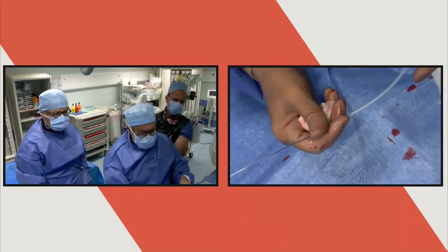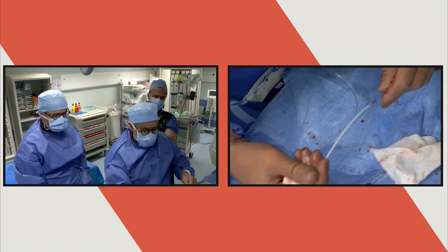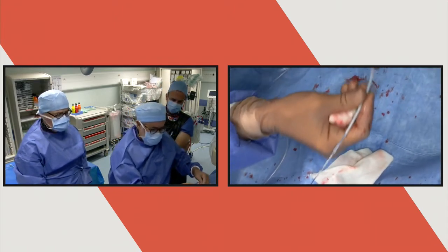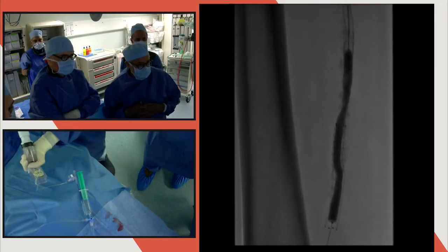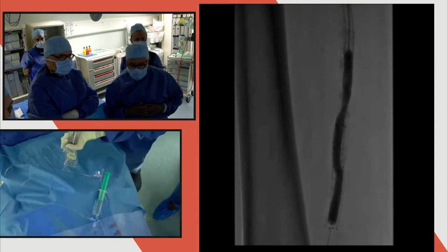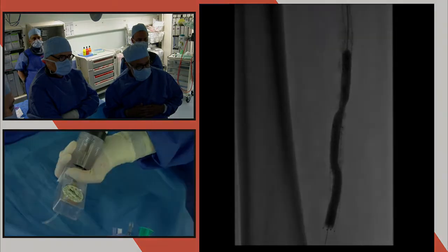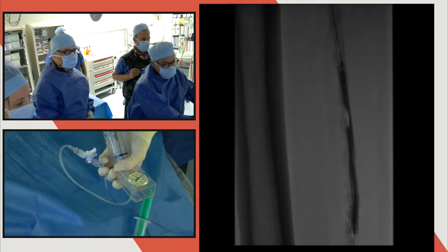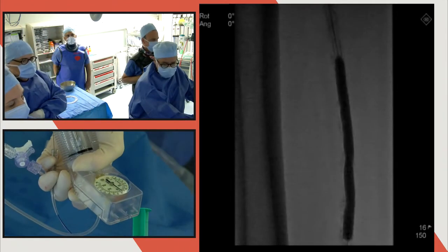It comes with a cover that we are going to extract in order to protect the coating. We have a timer here. So I usually inflate a DCB for 3 minutes. The balloon expandable stent looks already much better dilated than before. It's the same balloon that is used.